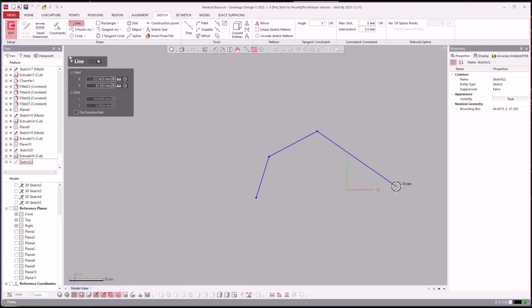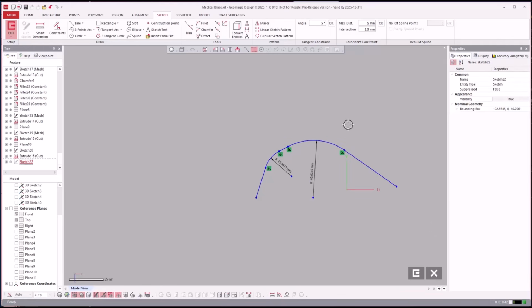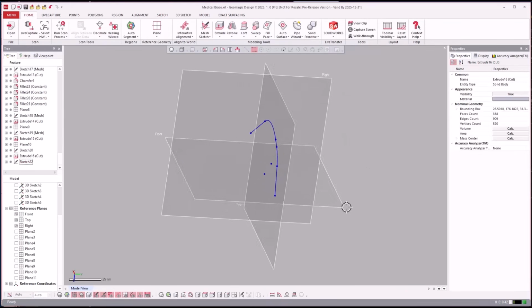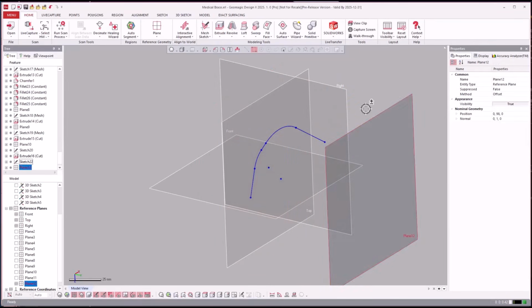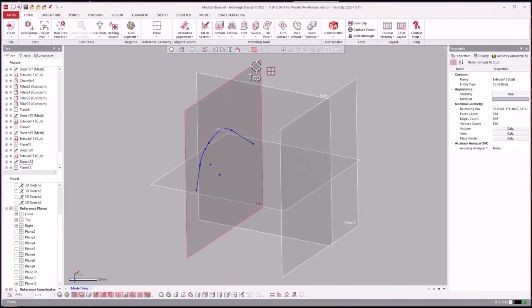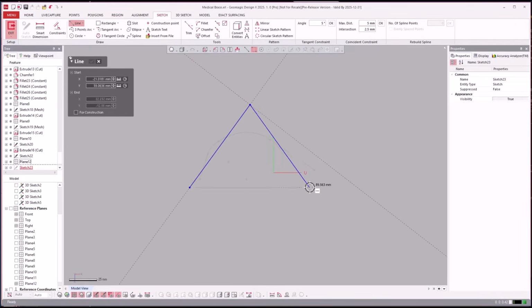I'm just randomly drawing here. 3 lines. Then we'll click and drag and add some fillets. So you have this, and then I'm holding control. If you hold control, that's a shortcut. When you roll over a plane and hold control, you can offset a plane, which is really handy. And then now if I come over here, I'll just do 2 line segments and 1 fillet.